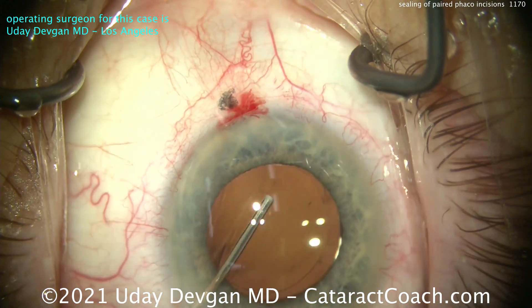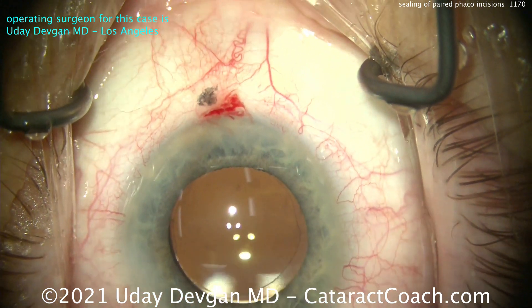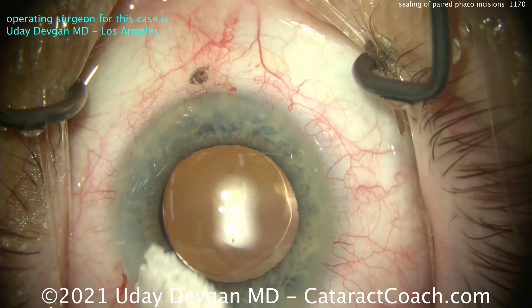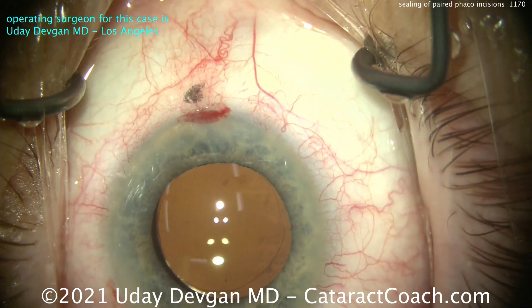I had this video in mind as I was doing this case — this is a great video to show. Let me show you what we've got here at the very end. Hydrate the main incision. That's a beautiful case. Look — without hydrating it, that nasal incision is already sealed. And we knew that. So take this lesson to heart.